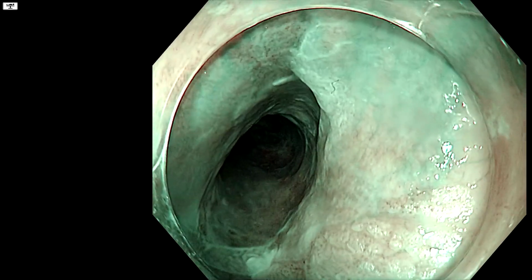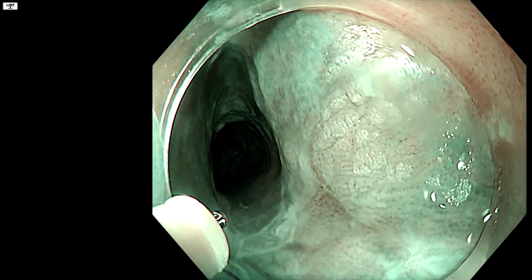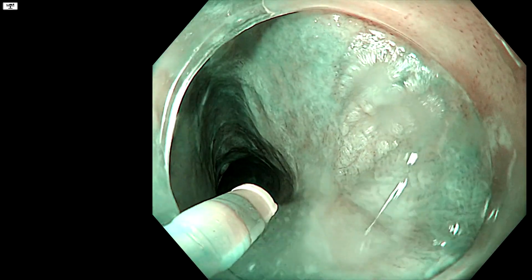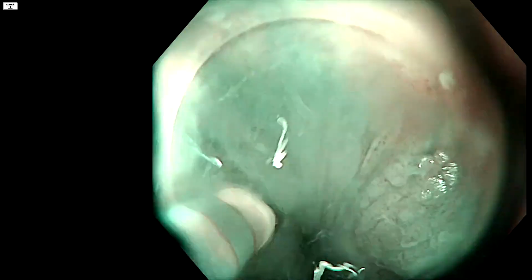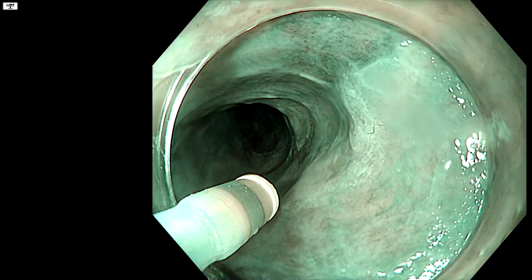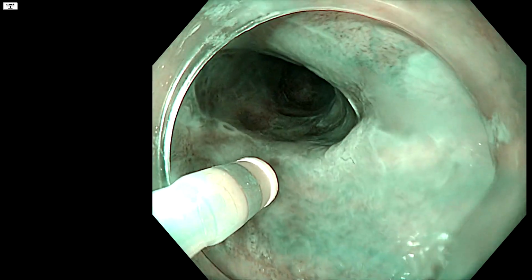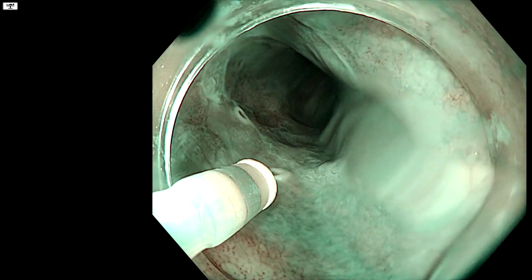I like to mark with the tip of the knife out. I know some people don't. We're right down on the stenosis here. This can be very, very difficult to resect, of course. So I want to put a mark beyond here, but of course I'm with the expectation I'm not going to get very far down there, that's for sure. Staying on normal.